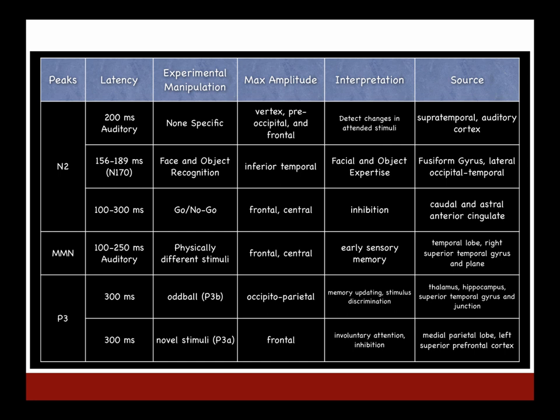So, yeah. Is it possible to record all these components from a single electrode? Yes, it is possible to record almost all of these components from a single electrode, although nowadays it is often cheaper to buy multi-electrode systems than to build your own single electrode system. That said, a lot of these components are often measured with particular paradigms, so you would likely have to pick the right paradigm for a particular component. And from a single experimental condition? Not necessarily from a single experimental condition. So, yep.